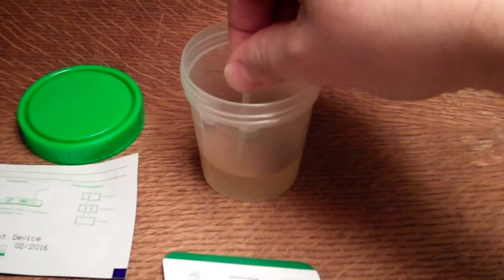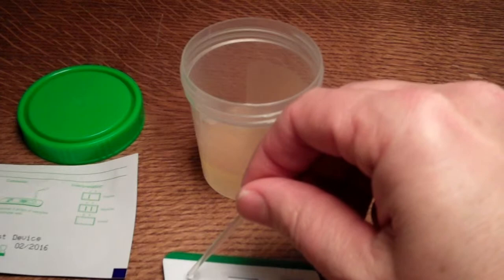To start the test, it's very simple. You take, in this instance, the pipette, squeeze the pipette, take a sample of urine, and it's three drops in the sample well. One, two, three.